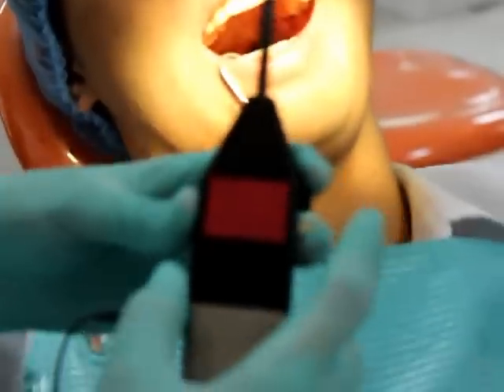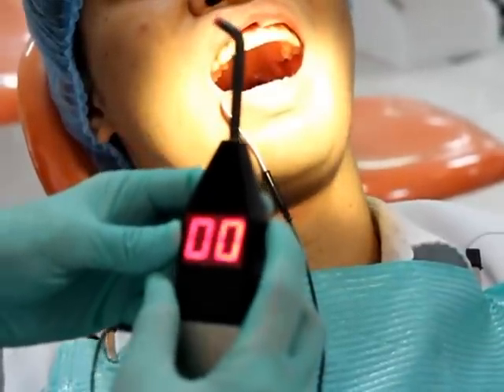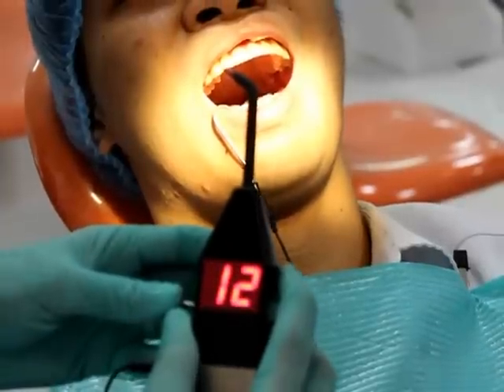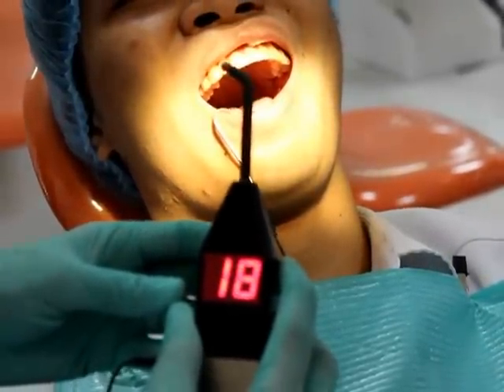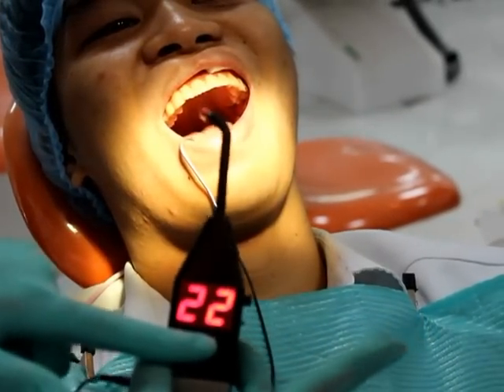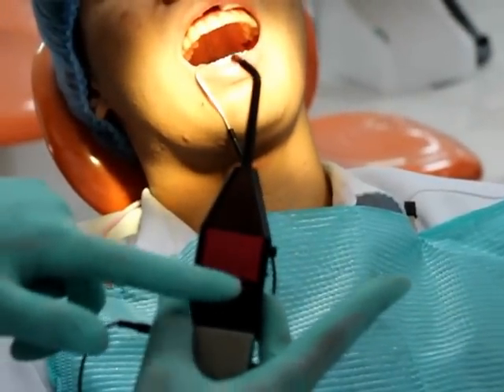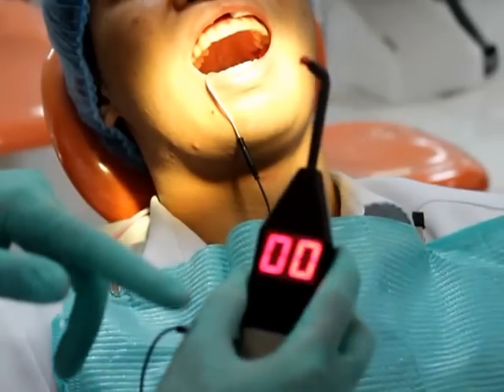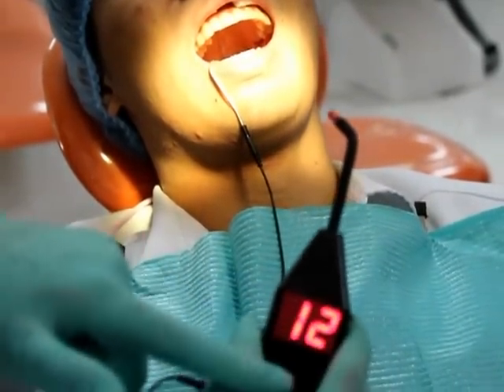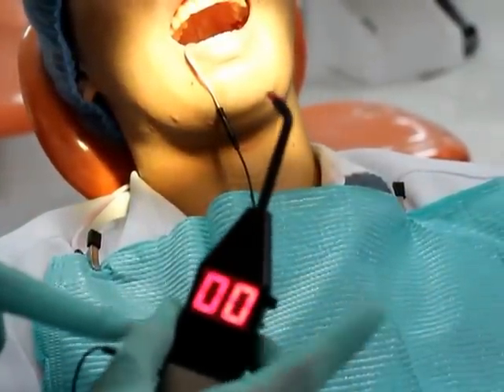So what are you supposed to see? Readings here. Okay, you have to press the button. Continue pressing it until the patient feels it. Once the patient feels it, you remove your finger. So the reading that you're supposed to give me is 22, and tell me the interpretation. What does it mean? The tooth is vital. But if it reaches 64 and the patient did not feel anything, that means the tooth is non-vital. Is that clear? Okay.